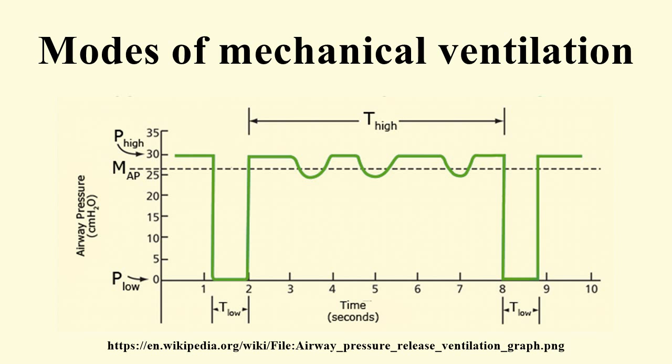Mode name: SIMV volume control plus. The operator sets the tidal volume but not the inspiratory flow. Because setting volume alone is a necessary but not sufficient criterion for volume control, the control variable is pressure. Spontaneous breaths are allowed between mandatory breaths so the breath sequence is IMV. The ventilator adjusts inspiratory pressure between breaths to achieve an average preset tidal volume, so the targeting scheme is adaptive. The mode tag is PCIMVa,s.